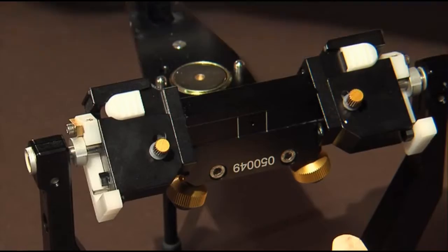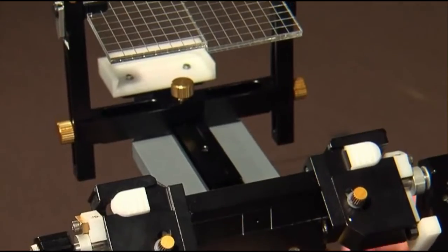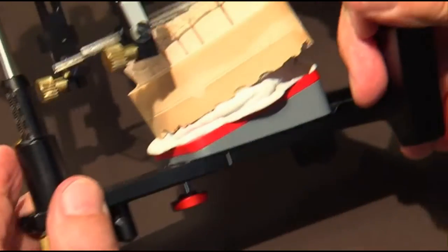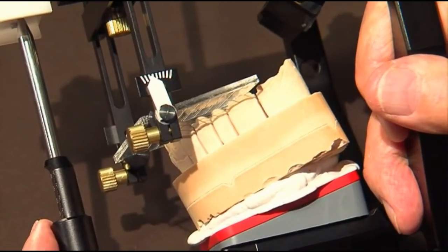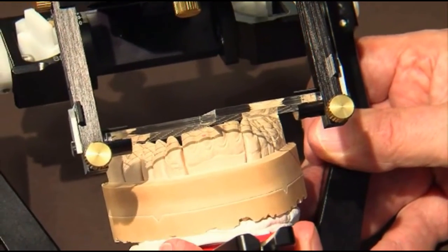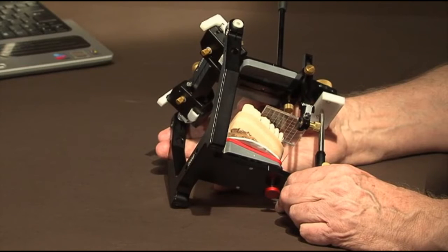The measurement table is placed in the articulator. Close the articulator carefully and observe the position of the occlusal plane relative to the prepared teeth. The articulator is now checked, especially the space between the prepared stumps and the programmed occlusal plane.